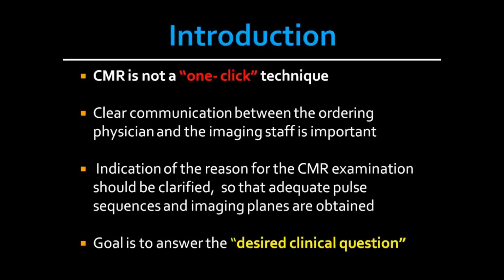So CMR is not just a one-click technique. It's not like CT, where you put the patient there and just click, and that's it in a few seconds. No, it's more complicated, but it's very, very beneficial in cardiology. However, there should be clear communication between the ordering physician and the imaging staff that are performing the CMR.